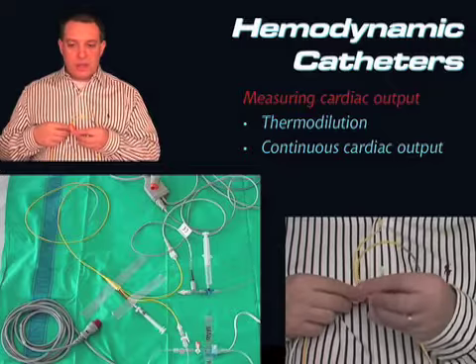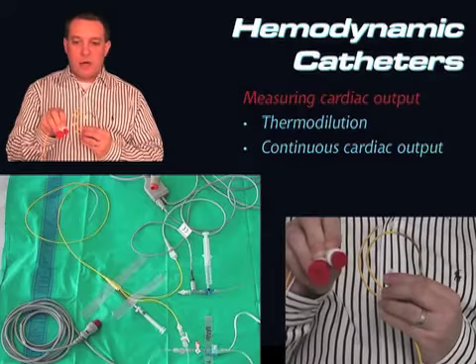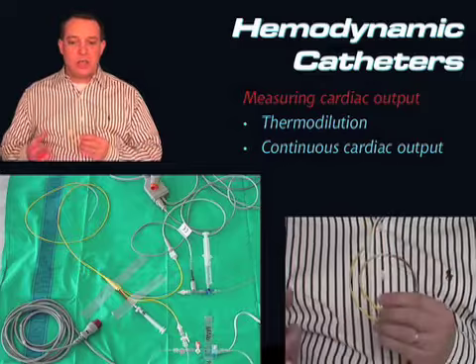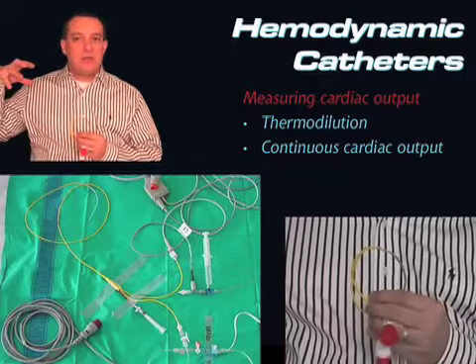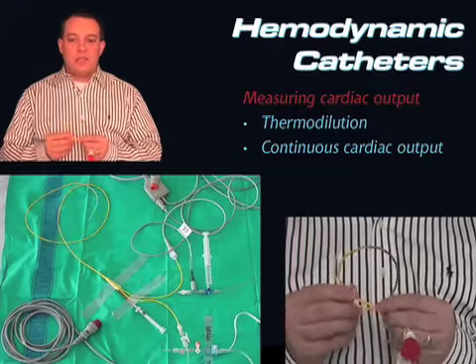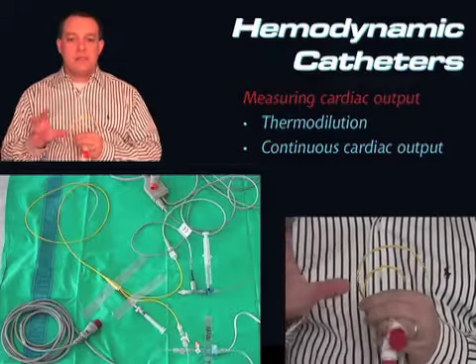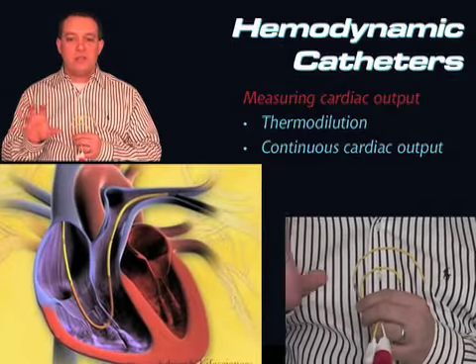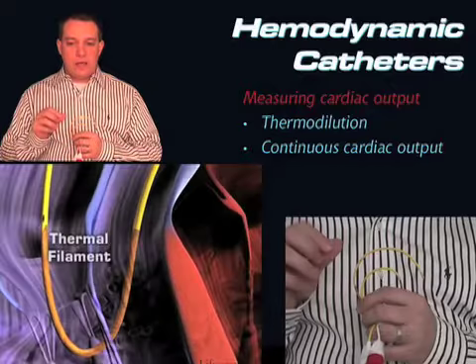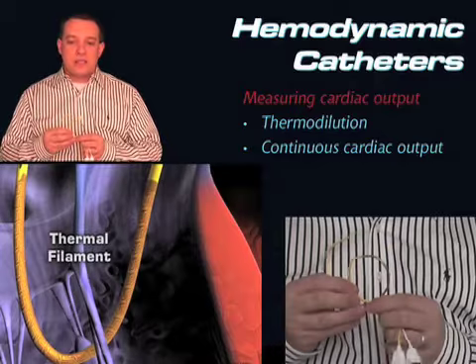So on the continuous cardiac output swan, you have two separate cables that attach into the vigilance monitor. And the way that this one works, we don't have to mess with any of that injectate junk anymore. Instead of having to have that extra bag of fluid and the syringe and push it and all that good stuff, we don't got to do that anymore. With the continuous cardiac output swan, it's designed so that at predetermined periods, and it's something that you set in the vigilance monitor, set at like every 30 seconds or every 60 seconds or whatever, this is going to heat up.